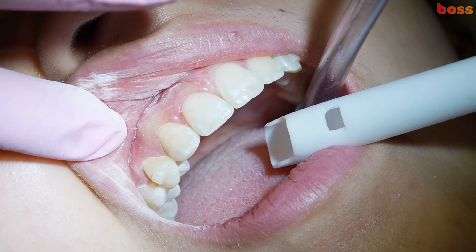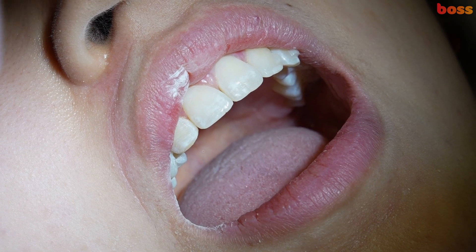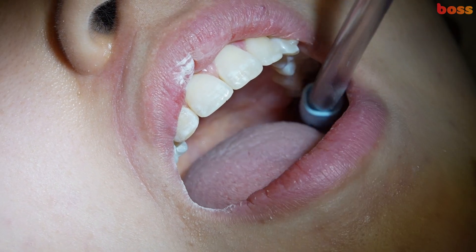You want to be careful that you're working within enamel. Use a tungsten carbide to finish off.